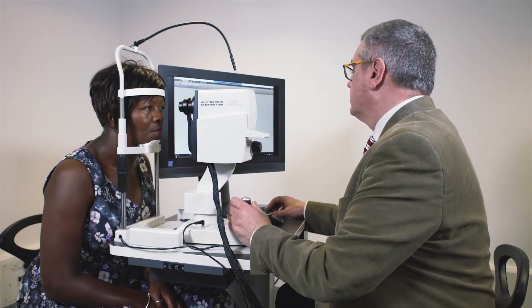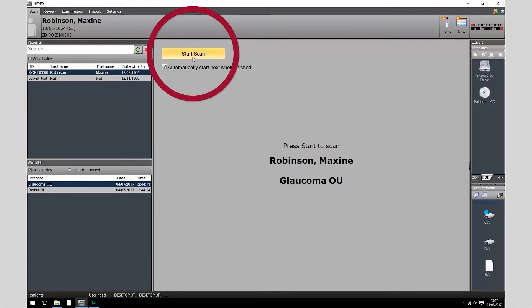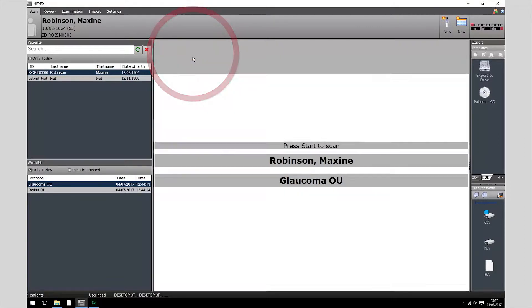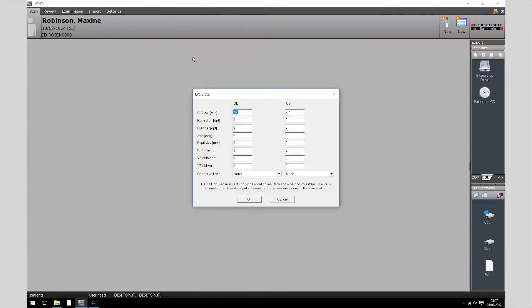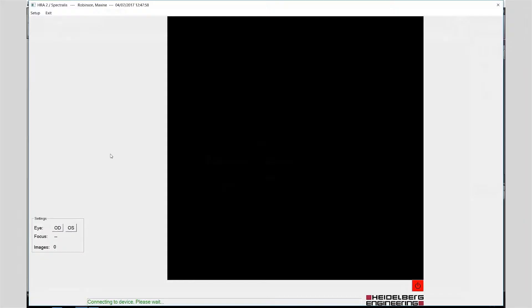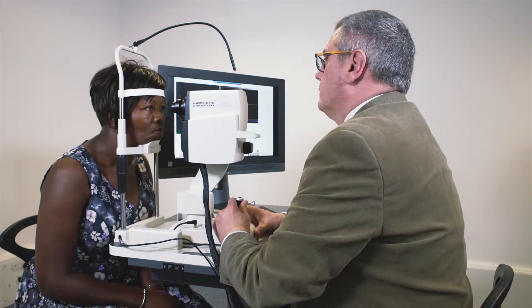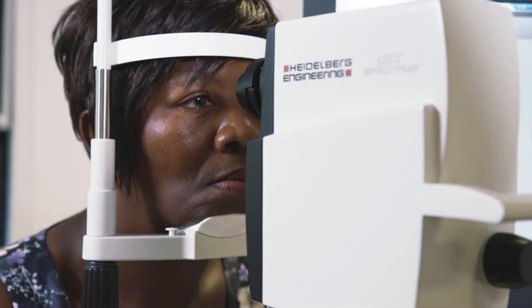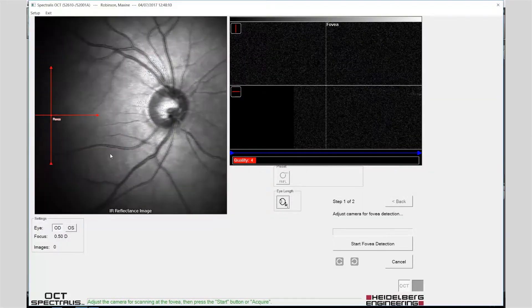Once the patient is positioned comfortably, press start scan to begin acquiring images. The eye data fields can be populated with information from the autorefractor keratometer or entered manually by the operator. The fundus image is aligned by sliding the camera head forward, keeping the reflex from the patient's pupil central.